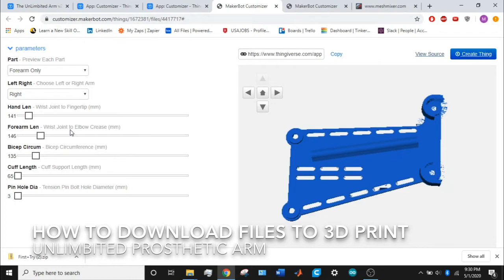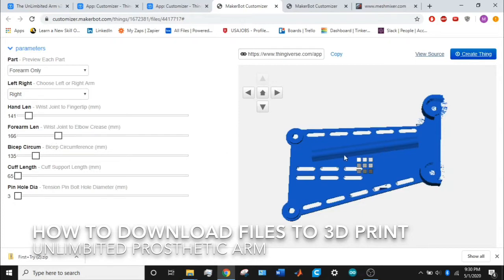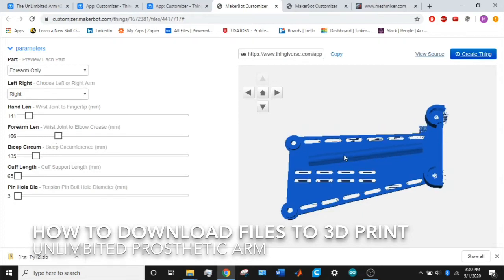The wrist joint to elbow crease measurement is from the tip of the amputated limb all the way to their elbow crease in millimeters. Once you put that in, you'll see this part change accordingly—the forearm part mainly, because the forearm part will increase in length by the wrist joint to elbow crease measurement.